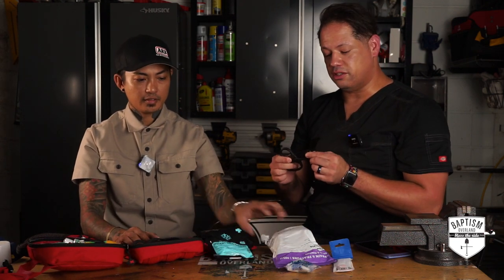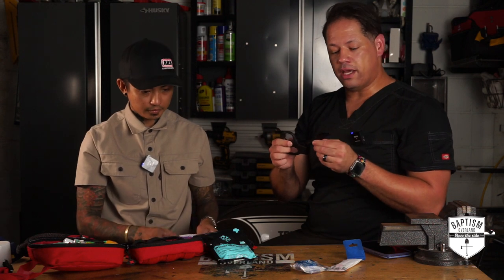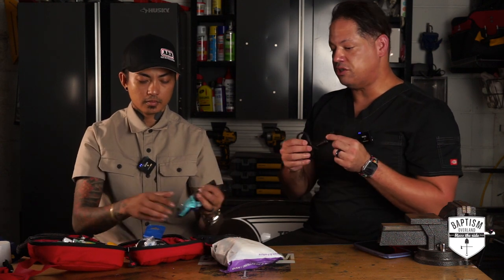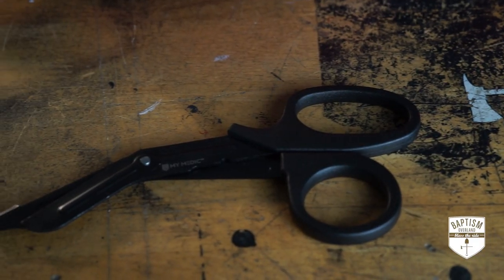Trauma shears — got to have trauma shears. It is so important to have them that a lot of medics and ER staff literally have them on their waist so they're easily accessible. Trauma shears is definitely a must. I know a lot of people in the medical field who carry them every day no matter where they go. This pair looks nice and robust versus some of the plastic ones from cheaper first aid kits.